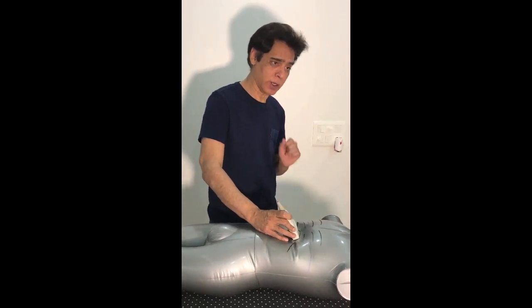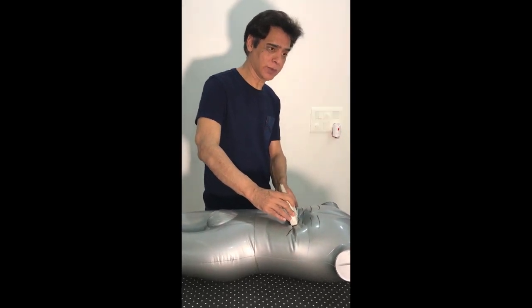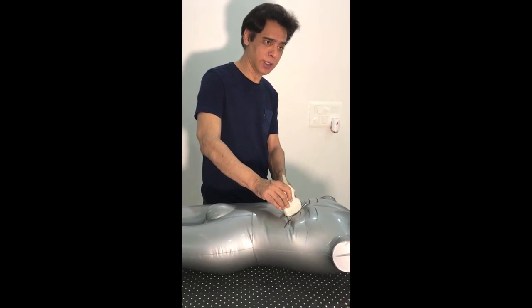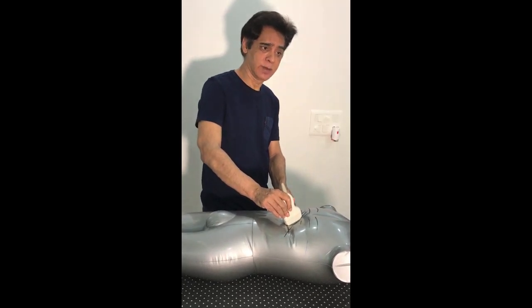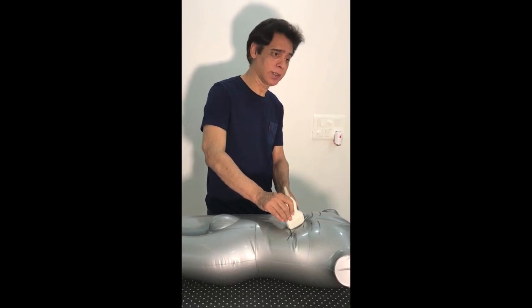So what is the way out? For this, what you can do is to again rotate the probe from transverse to the longitudinal section, and like this I am rotating, and after rotating you get the head of the pancreas in long axis, longitudinal section, which is triangular in shape, and just posterior to that is the CBD.